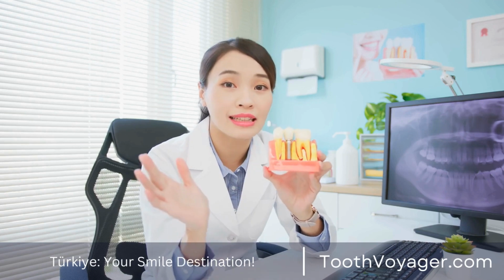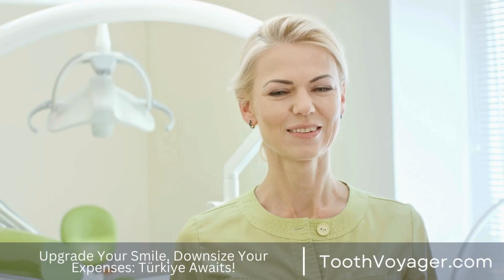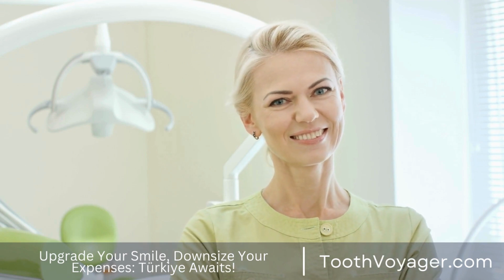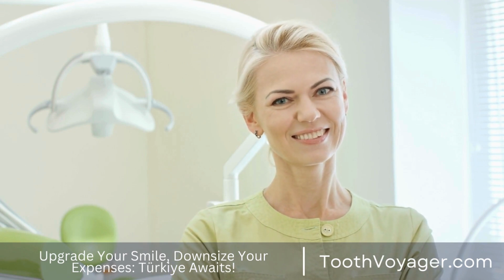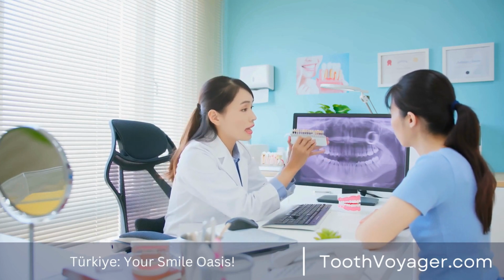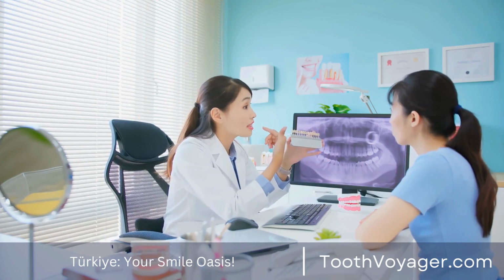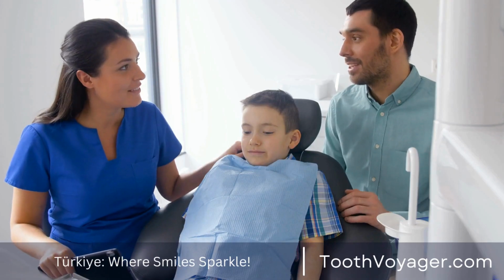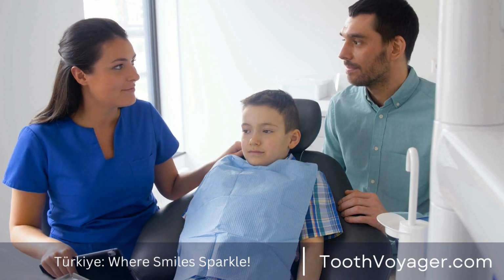Types of dental bridges. There are many kinds of bridges for dental use recommended by dentists, depending on the place of the missing teeth and the state of the surrounding teeth. Most commonly, bridges used in dentistry are the traditional ones, bridges with a cantilever, along with Maryland bridges. The traditional bridge is the most commonly used kind of dental bridge.